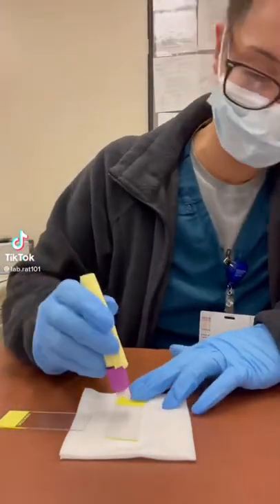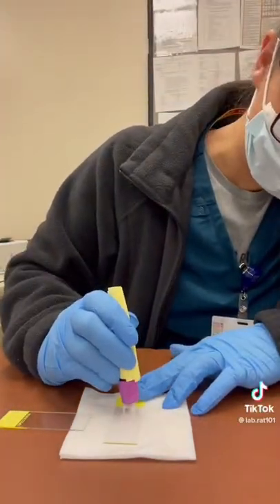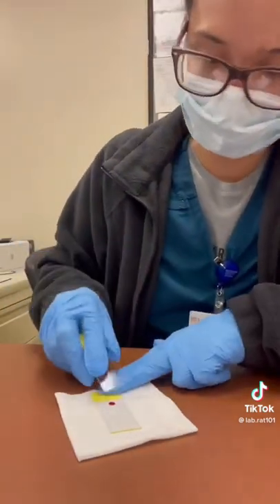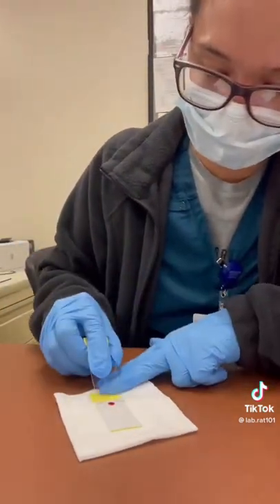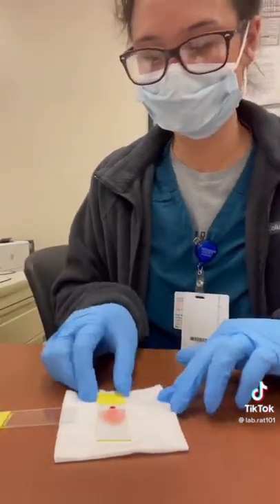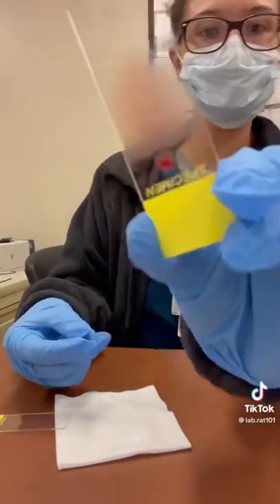This video is of me doing a complete blood count manual diff. I put a dollop of blood from the tube onto the slide and then slide this one across — it should come out looking like a bullet. This one was actually a little thick, but it's okay. It'll still work.